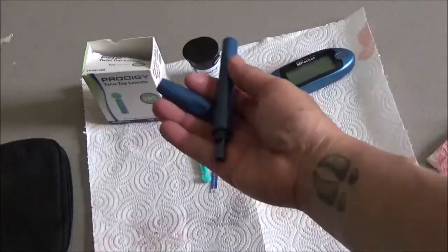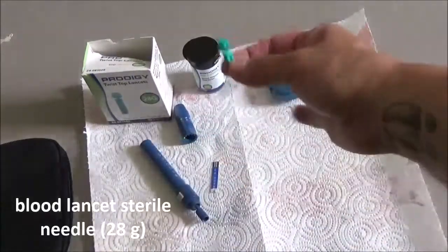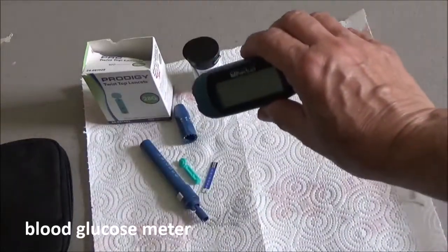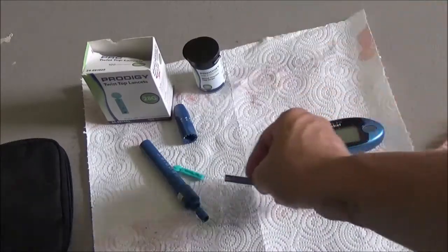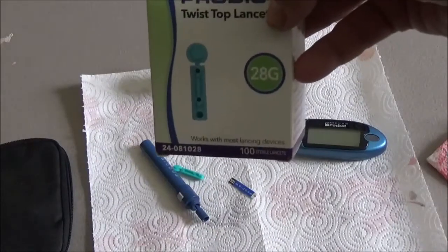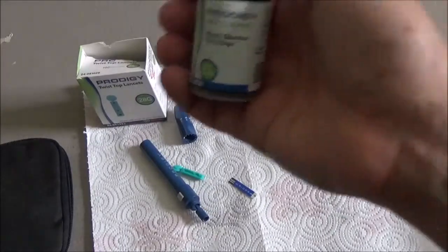Okay, so this is a lancet holder. This is a sterile lancet. This is a blood glucose meter, and this is a blood glucose test strip. Okay, my lancets are 28 gauge sterile lancets. My blood glucose test strips. Okay, all right.